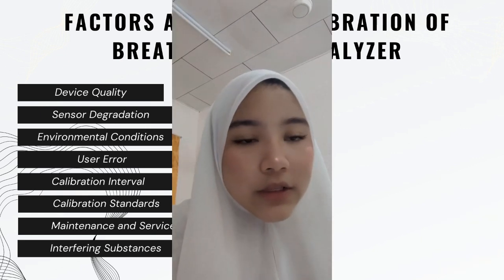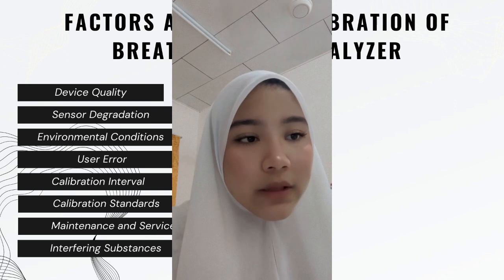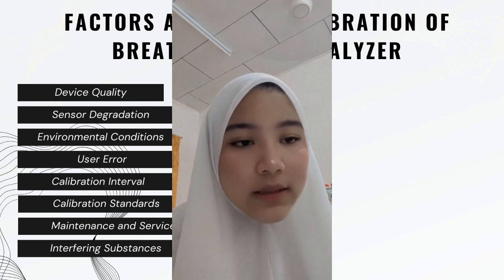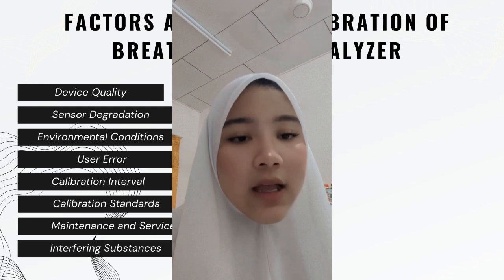Next is calibration interval. Breath alcohol analyzers typically require regular calibration intervals to maintain accuracy. For the next is calibration standards. The accuracy of the calibration process depends on the quality and reliability of the calibration standard used.